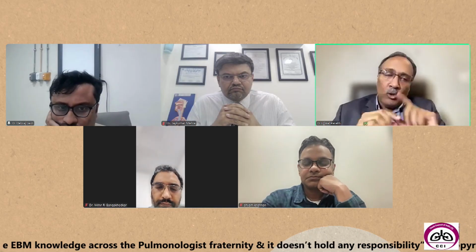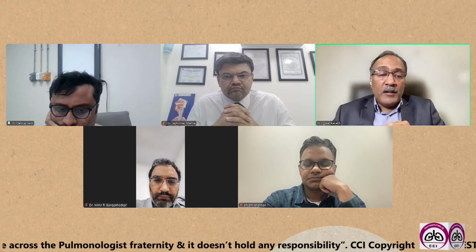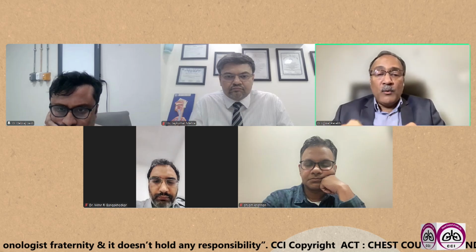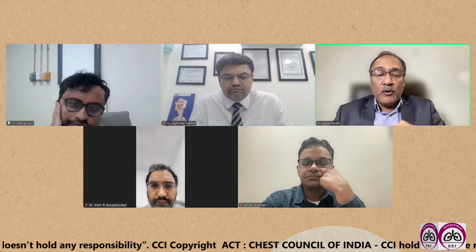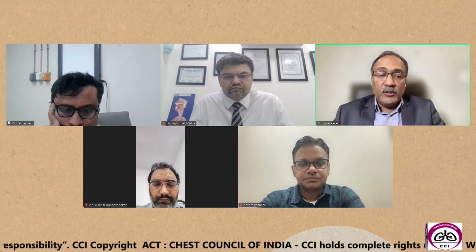So that is also one thing. Though it has a caveat that it's not full control of ventilation. So possibly in patients who are COPD patients or who have a history of CO2 retention, the CO2 levels can go up. Therefore, there should be a CO2 monitor also attached whenever we are doing the procedure under HFNC.